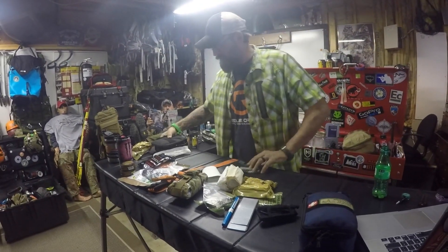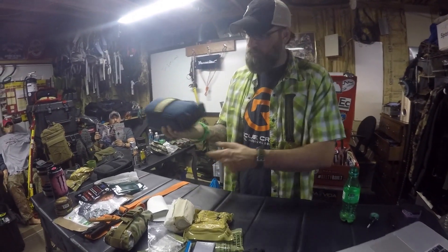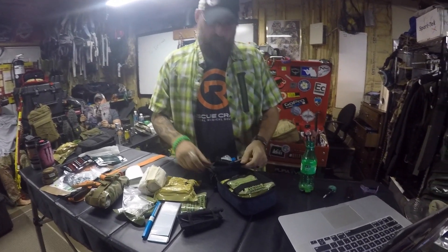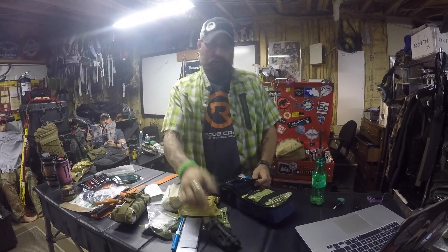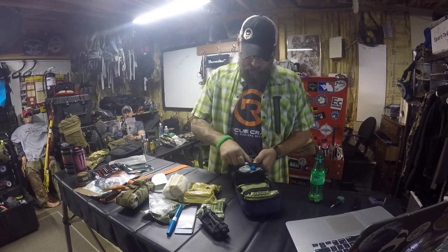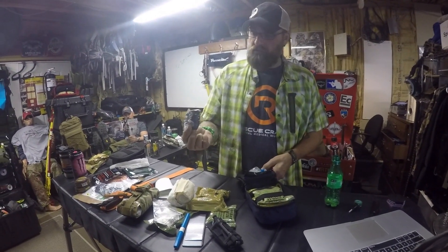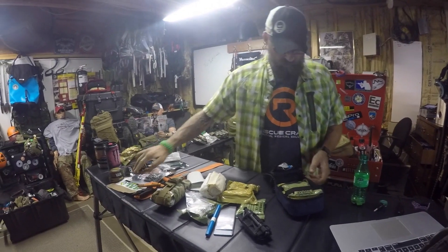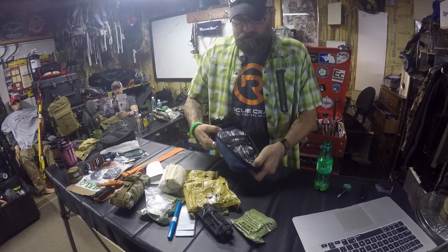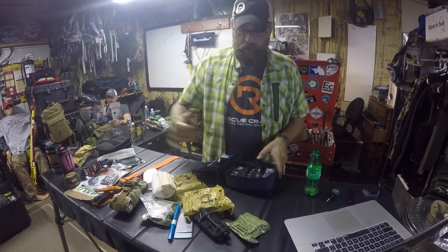The last one is a little bit thinner — this is the regular Operator IFAC from TMS. We have the Soft TW on the bottom in a flat roll, ITS does the flat roll on it and it's a phenomenal way to do it. Inside: Beacon chest seal double pack, duct tape, an NPA, a 14-gauge needle, vacuum-sealed gloves, and combat gauze. In the back we have a vacuum-sealed ERS strap — an evacuation and rigging strap. We can do vertical work, horizontal drags, rig for stairwells, corkscrews, even throw them out windows. We've actually hoisted people up into a helo with an ERS strap.